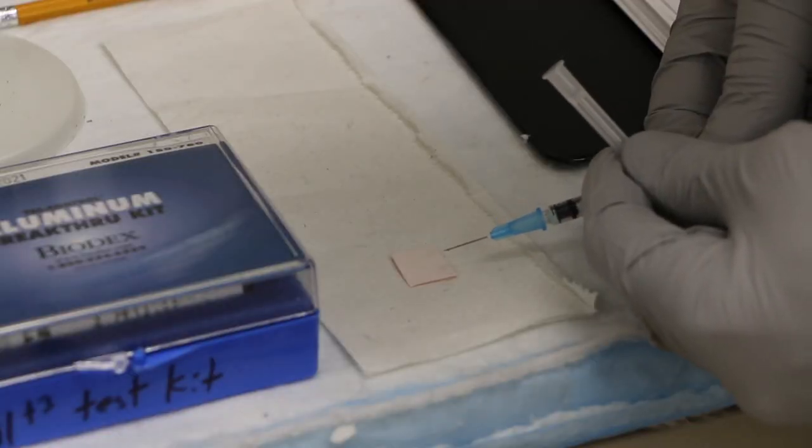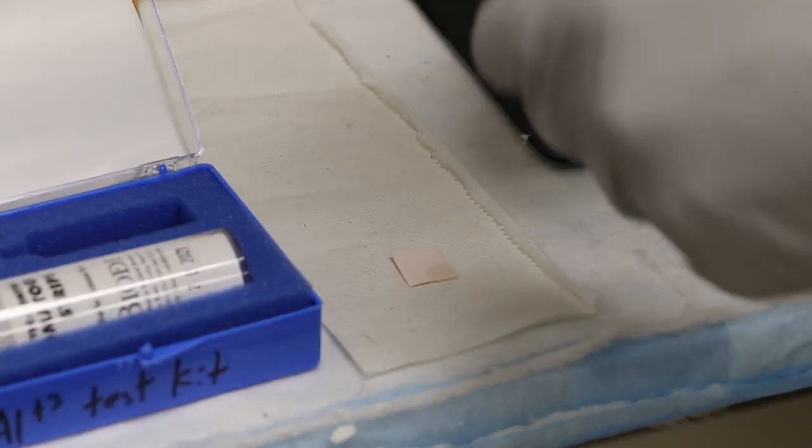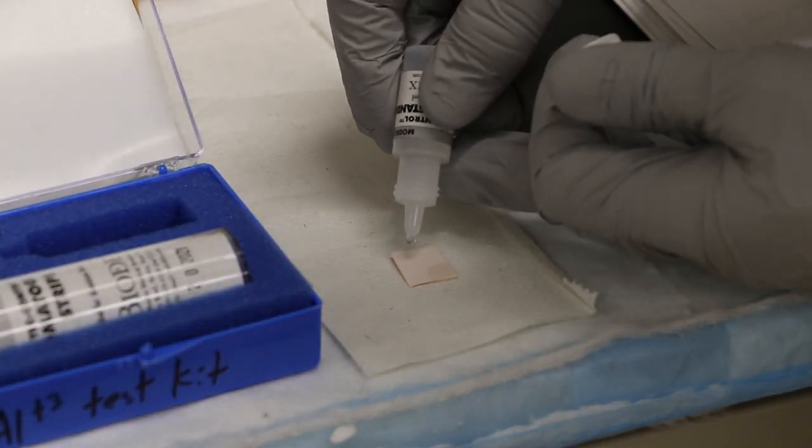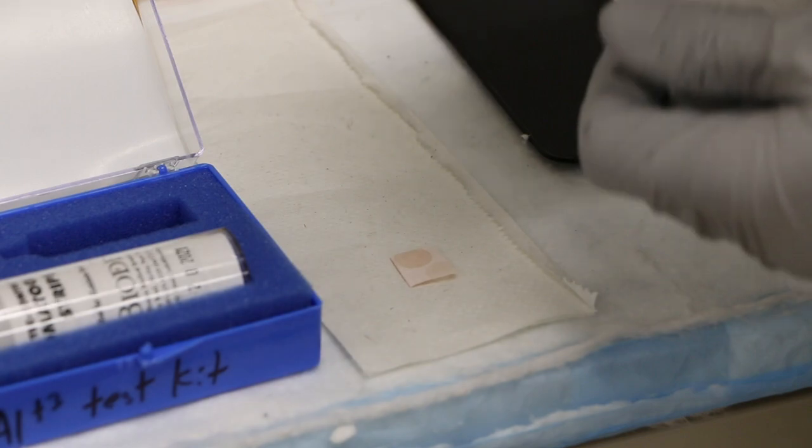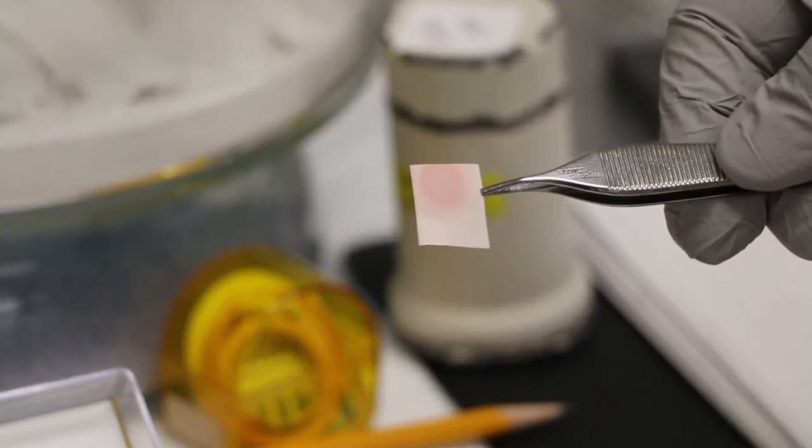Using the aluminum breakthrough kit provided by the manufacturer, place one drop of the eluate on the corner of the chromatography strip and one drop from the aluminum standard on the other corner, and look for a color difference. If the standard should appear much lighter than the technetium, then there is excess aluminum in the eluate.